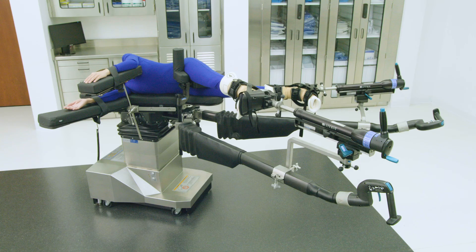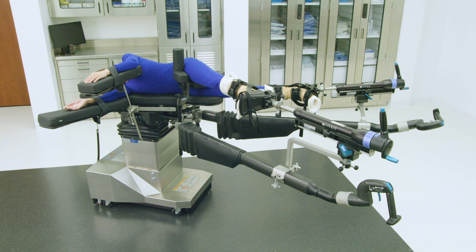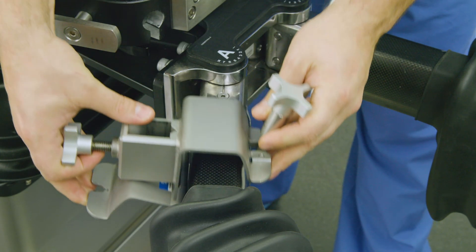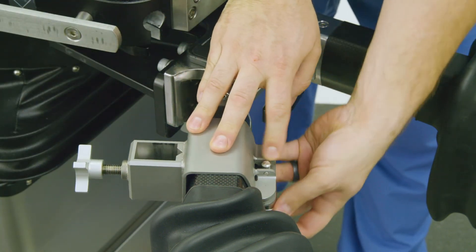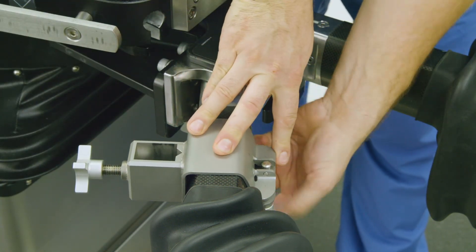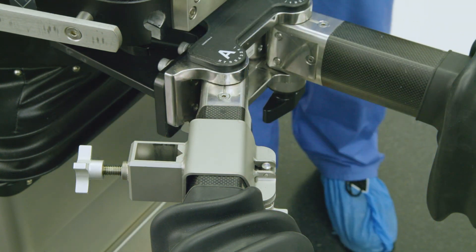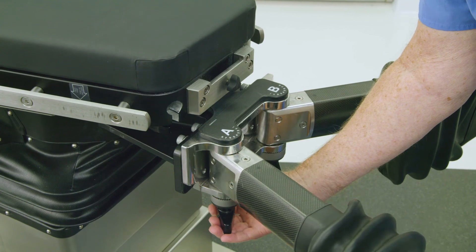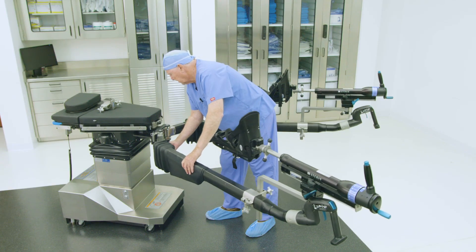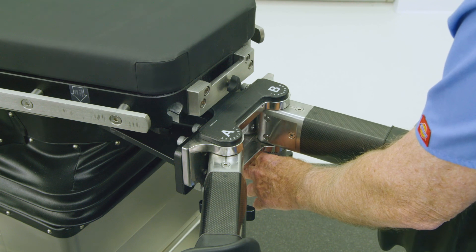Preparing the OT table for lateral positioning is much different than most other supine orthopedic cases. Start prepping the table by installing an accessory spar clamp on the short end of the abductor spar of the non-operative leg spar. Position the accessory spar clamp so that the hole is on the outside of the spar. You may need to readjust the A and B rosette positions temporarily to get access to install the spar clamp.